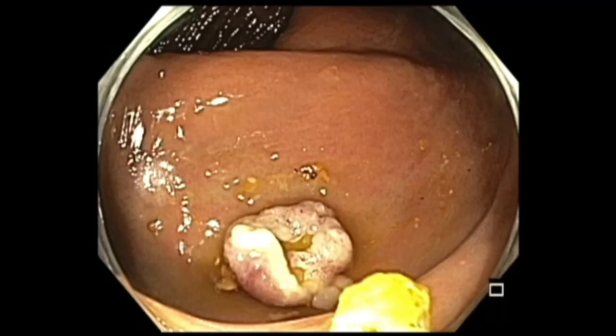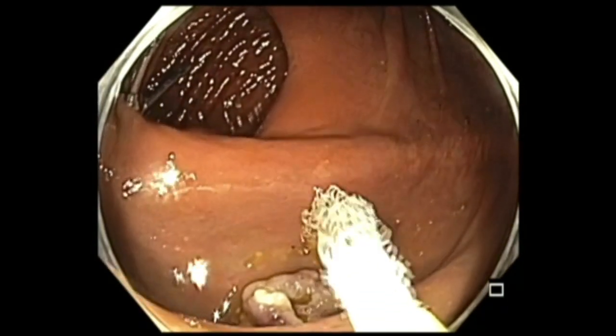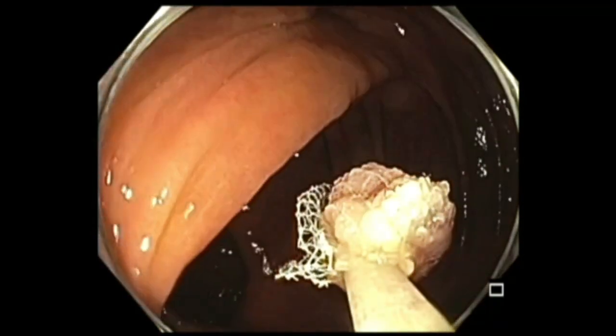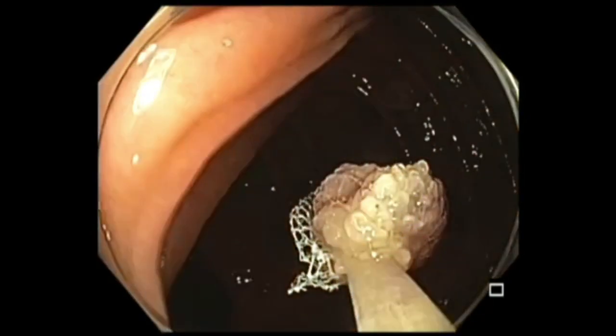So let us look at an image or a video. Here is a large polyp that was cut, and we are using the retrieval net by opening and closing and then retrieving it. Once the scope comes out from the patient's body, we deposit this polyp in a formalin jar. If it is a large polyp and you want to have a definite assessment of the margins, then it is a good idea to pin that polyp to a cardboard and then deposit that cardboard with the polyp pinned to it in the formalin jar.